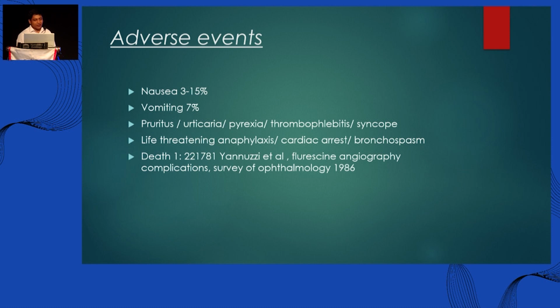A fair percentage of patients end up with nausea, vomiting, pruritus, and pyrexia. Look at the rate: it could be like 7% of your patients can end up vomiting. We have seen that. Something which happens in 10 or 20 seconds, if your patient starts vomiting, you are finished, and you will lose all the details. Also, very rarely, you have life-threatening things like anaphylaxis, cardiac arrest, and bronchospasm.